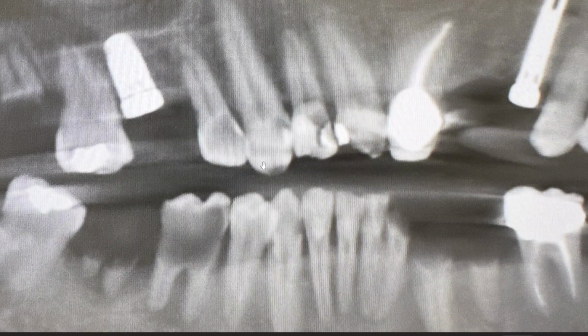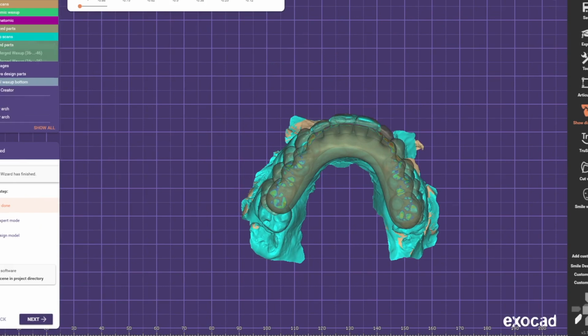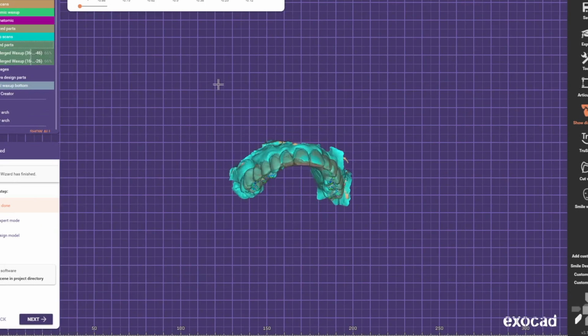And so Pano, PA, took some cross-sectional measurements, found out, yeah, we can get parts. It was either like Zimmer or BioHorizons. We ordered based on my recommendations. I said, let's get a 1 millimeter straight platform, multi-unit abutment. I chose that based off these records here, and that, hey, I've got this healing cap right here, I can see that. And so I'm taking a cross-sectional measurement of that healing cap.